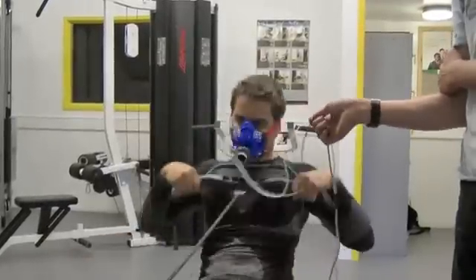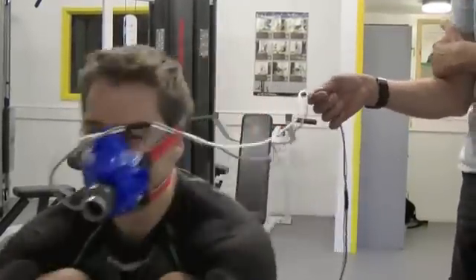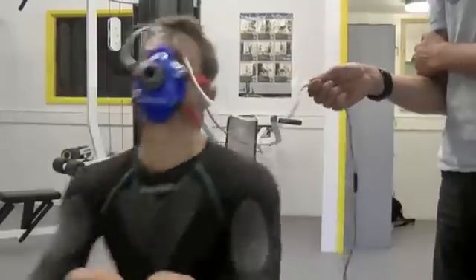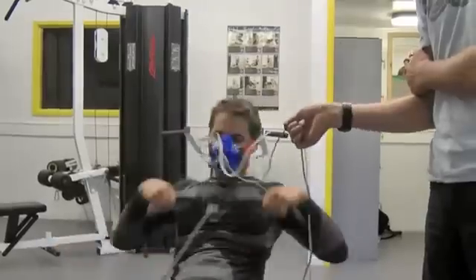Okay, that's 45 seconds to go. Good, Maren. Keep it going Maren. Come on, push it out — 30 seconds. Really hard. This is maximal. Come on now, you should be sweating. Really hard.